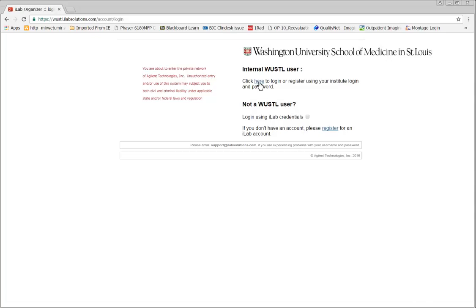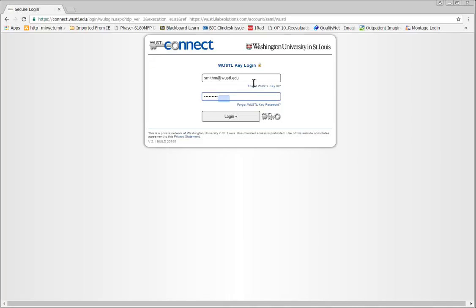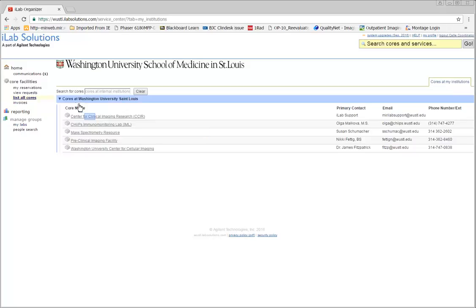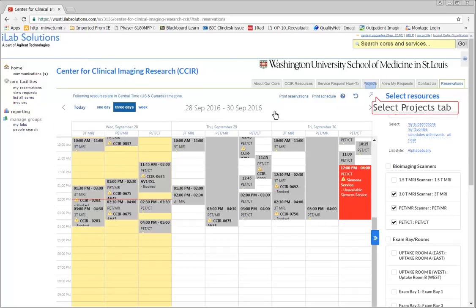First, log on to woostel.ilabsolutions.com and log in using your WoostelKey credentials. Click List All Cores on the left and choose CCIR Core. Then click on the Projects tab.